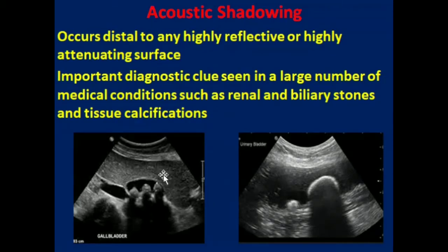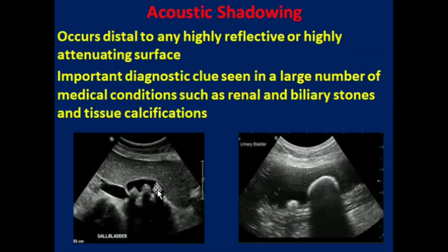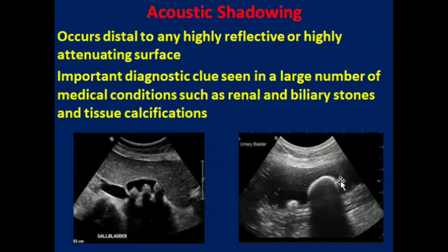In this image we can appreciate that within a cystic structure there are hyperechoic structures present. These are stones within the lumen of the gallbladder, and as we can appreciate, these stones are causing posterior shadowing. This is also the urinary bladder — a cystic organ containing a hyperechoic or highly reflecting structure in its lumen — and it is also causing posterior shadowing.